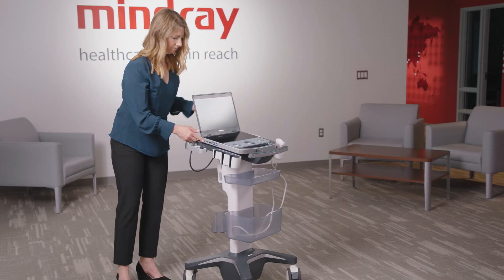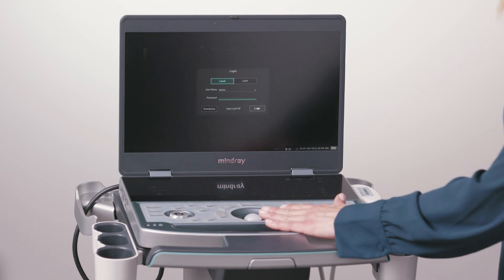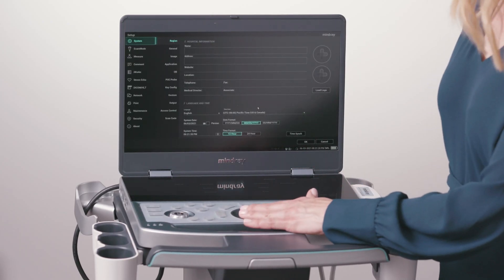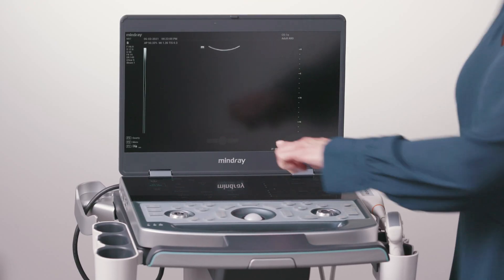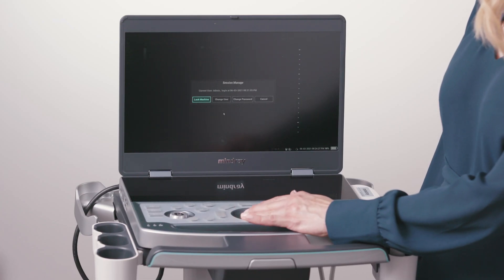When the system first boots up, an access control window will populate on the display screen. Select login. You can disable the user account control, add, delete, modify passwords, and edit privileges by going to Setup > System > Access Control. If access control has been set up, you must login with a username and password. When a user has logged onto the system, a key icon will appear on the bottom right corner of the screen. Here you can lock the machine, change user, and change passwords.